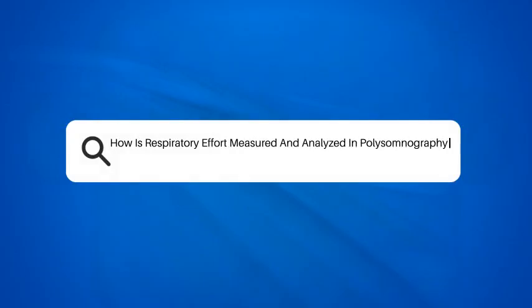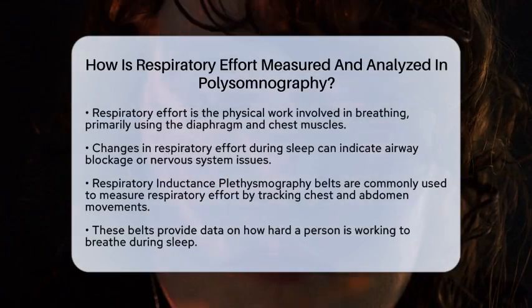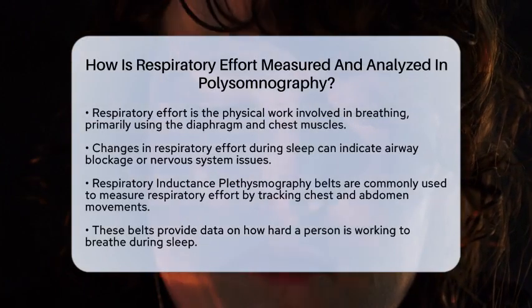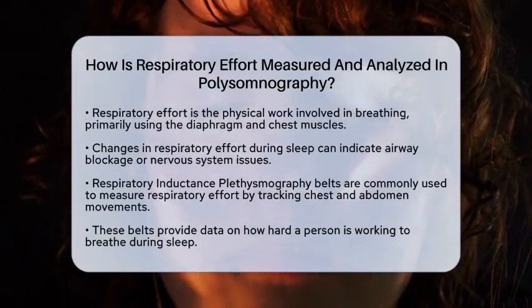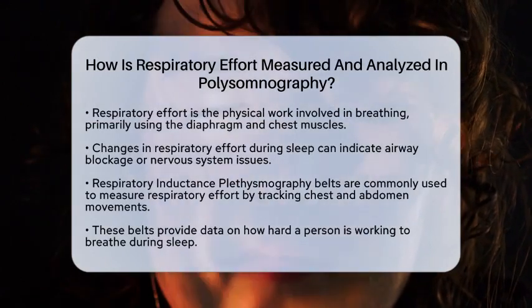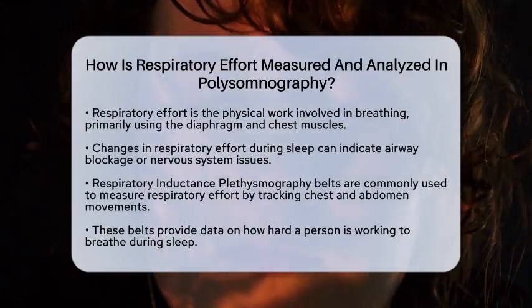How is respiratory effort measured and analyzed in polysomnography? Have you ever wondered how doctors measure your breathing while you sleep? Understanding respiratory effort is vital in diagnosing sleep apnea and similar conditions. Let's break it down in a simple way.